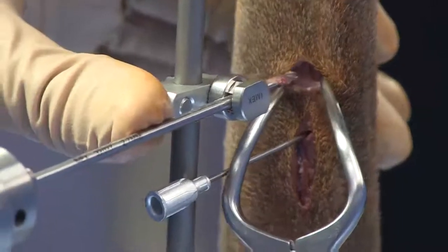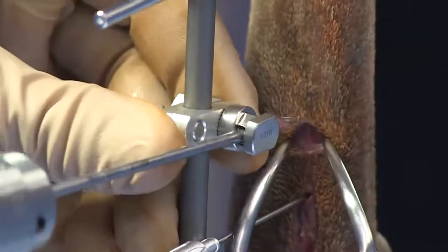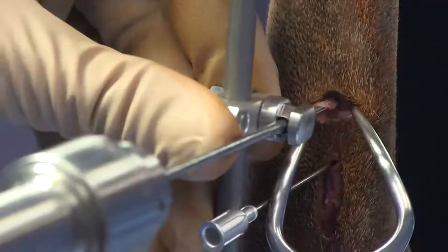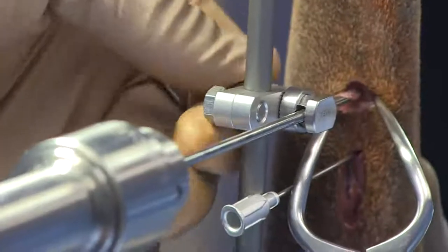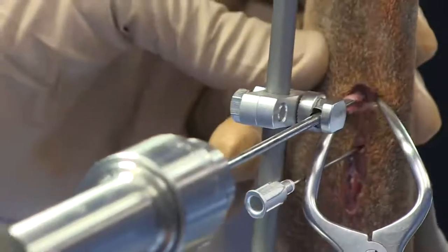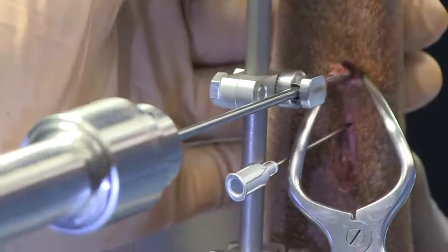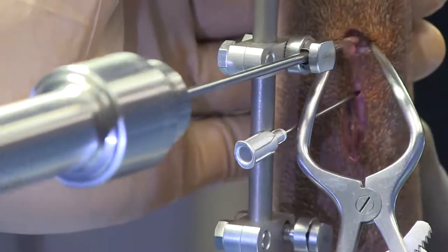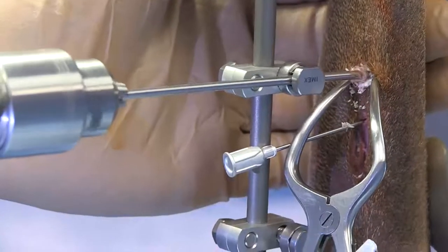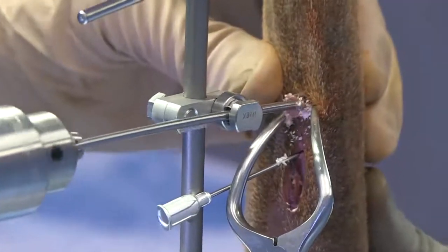I've got my drill placed through that clamp, which has the ability to move up and down and in different planes. Our plane is already established, so once we get our level appropriate, you can fasten it down just a bit to keep that position preserved — of course not too much because it'll just bind your drill bit. The rest is done for you because you've already got your plane established. That was us exiting through the opposite cortex.